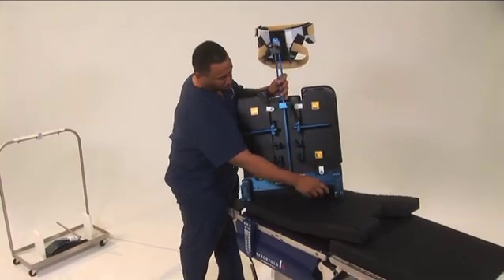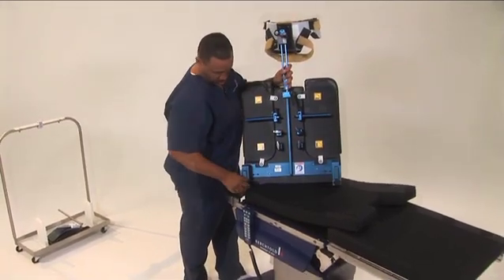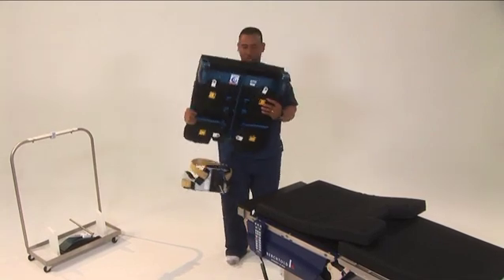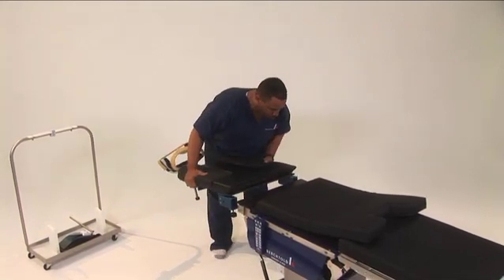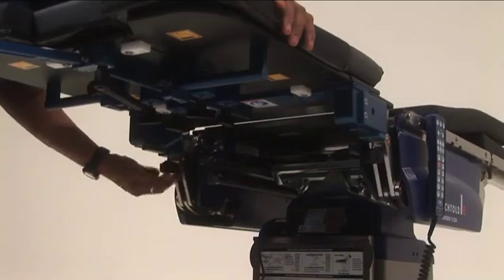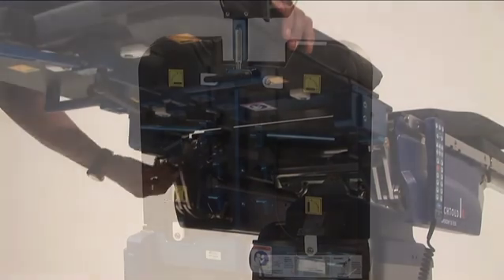Ensure the safety latches are retracted on the shoulder chair connectors. Slide the connectors of the shoulder chair fully onto the table spars where the back section was previously connected. Rotate the knob of the safety latch counterclockwise to engage the latch.